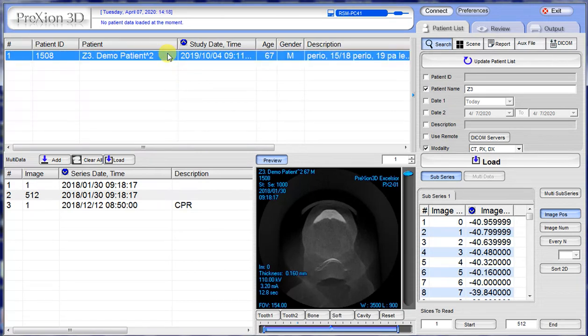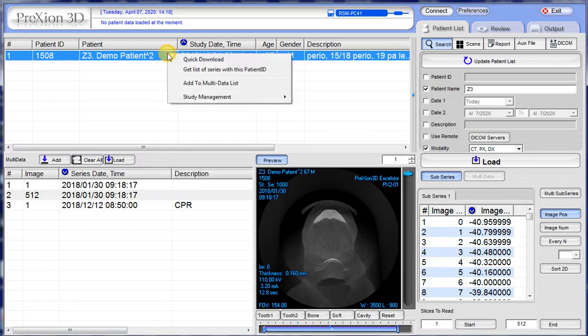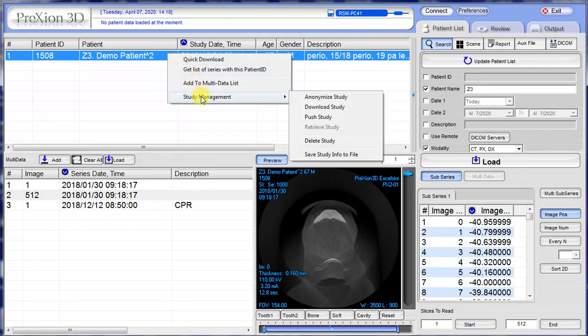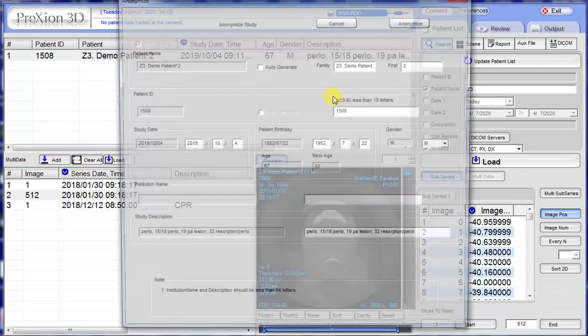On the mouse, you right-click, or you can use the touch pad to right-click. Go to Study Management, then go over to Anonymize. It's a funny word — anonymize — but think of that as your edit.